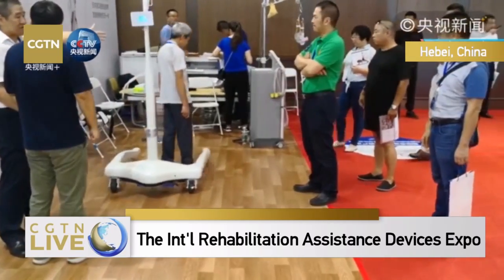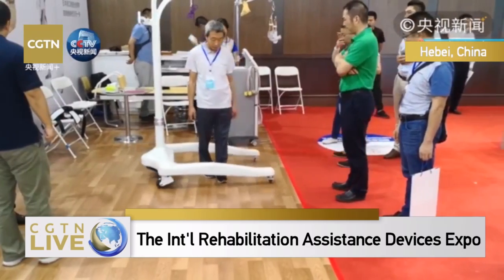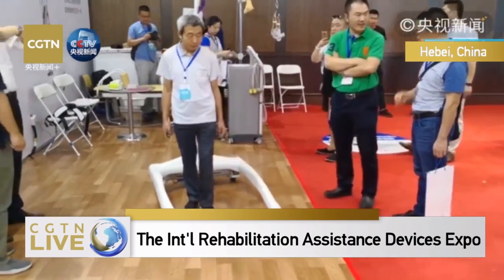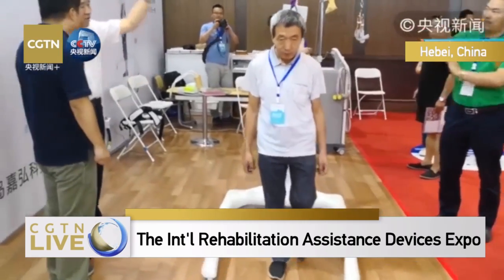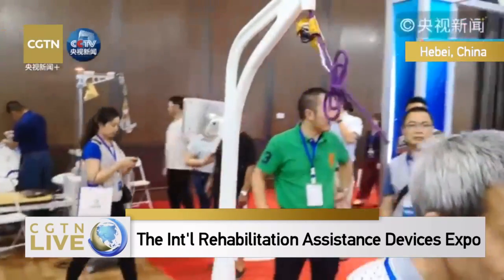If someone trips over, as you can see, here is a protection cable, much like those that are used with cleaners who have to clean windows high above.